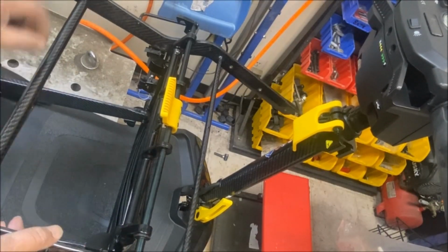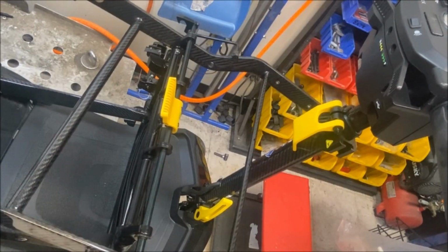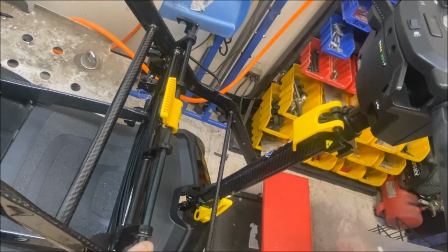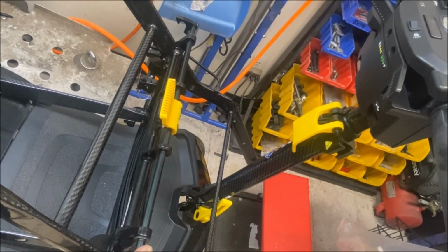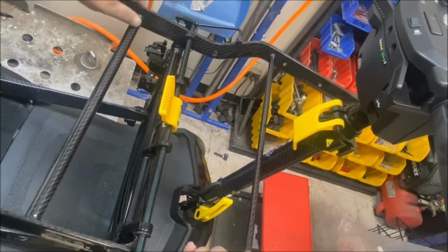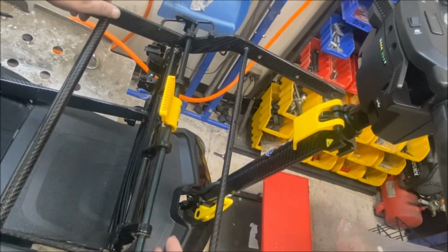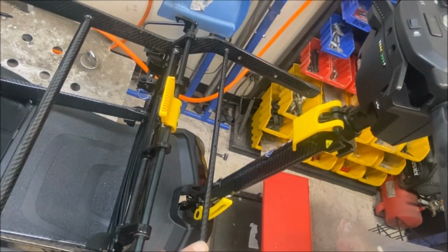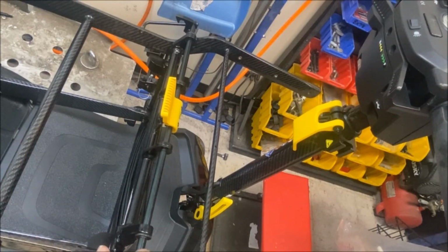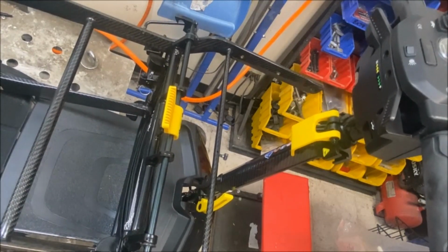Getting the frame piece out. I think I may have to remove this to get it off, because it's restricting it. Because the width is not going to give you any room. So I'm thinking you may have to remove the release bar. I didn't want to have to do that, but damn.